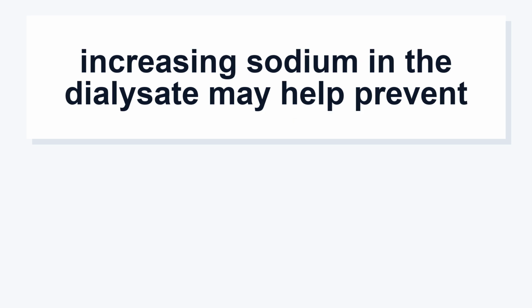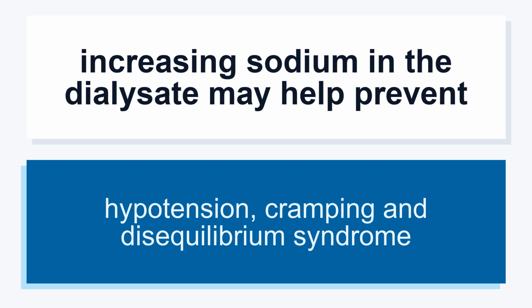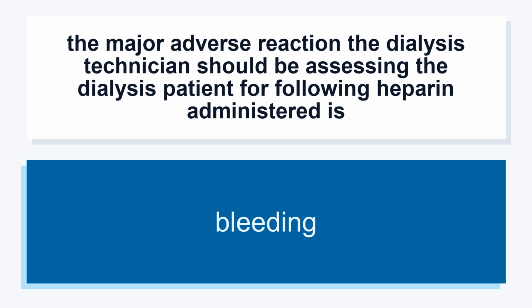Increasing sodium in the dialysate may help prevent hypotension, cramping and disequilibrium syndrome. The major adverse reaction the dialysis technician should be assessing the dialysis patient for following heparin administration is bleeding.